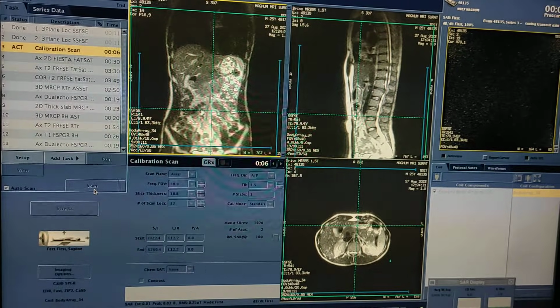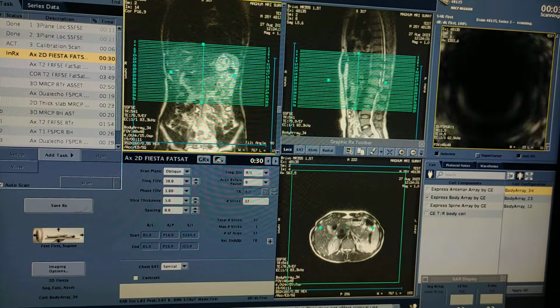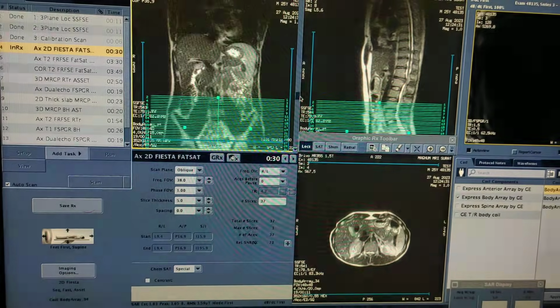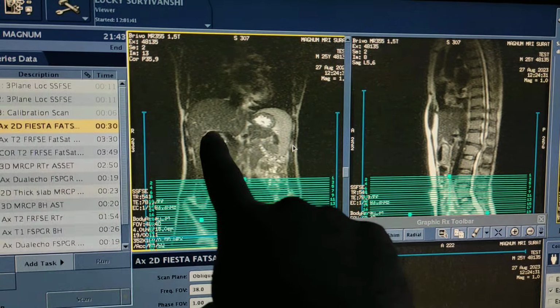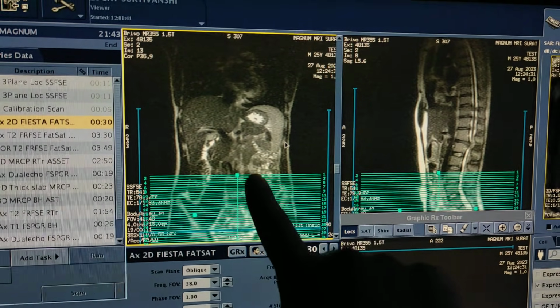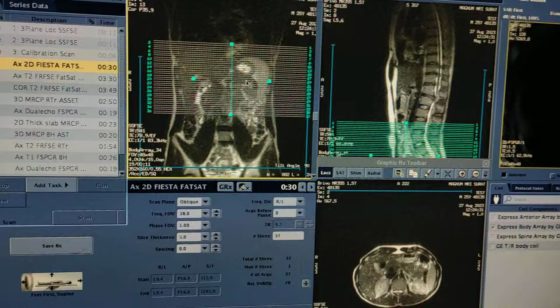Now first of all I will plan axial 2D FIESTA. We will need axial 2D FIESTA and coronal 2D FIESTA for planning. Anatomy of the CBD: here is the liver, from here the CBD comes out and drains over here in the bowel. In this localizer I am not able to see the CBD, but I will now take a 2D FIESTA for better localizing and a better plan.